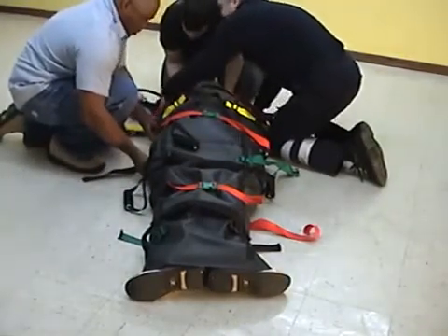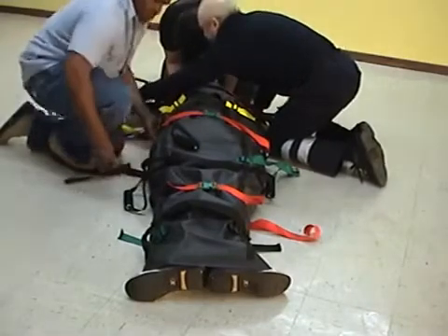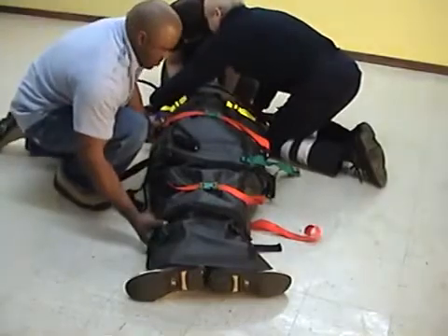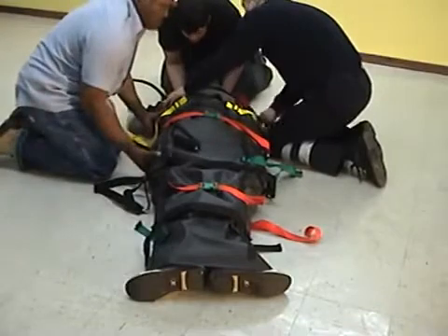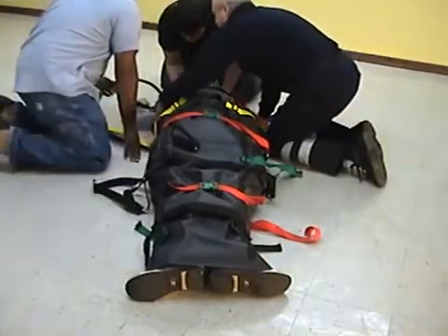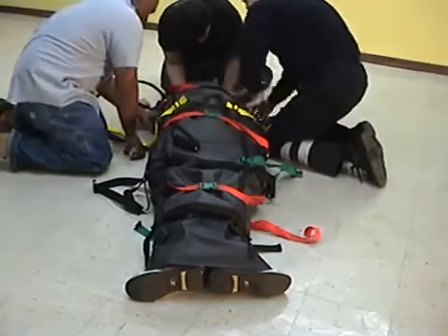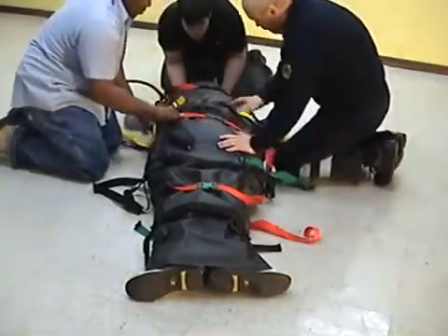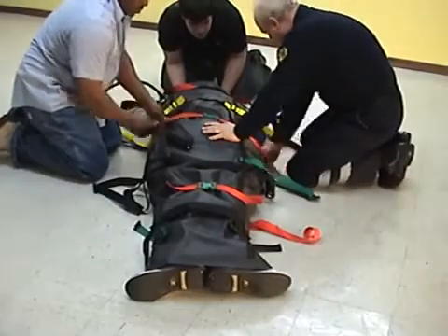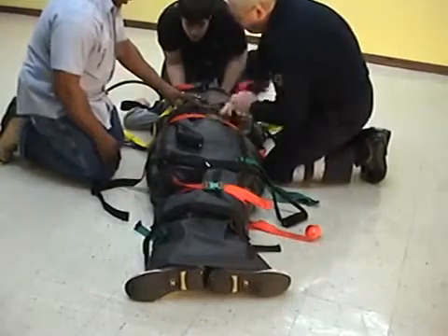Head designates which direction the patient should best be turned. Re-adjust the straps and move any limb close to the body for comfort. For example, an uninjured arm which may have been found outside the body area should be repositioned along the body for comfort when turning the patient. Head ensures that the red forehead straps are very snug and manually holds the patient's head in position.